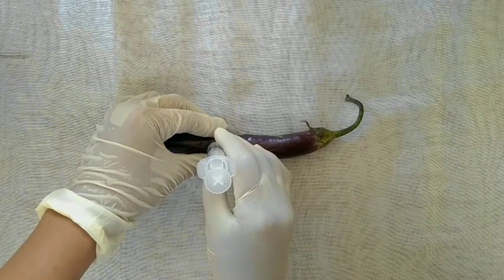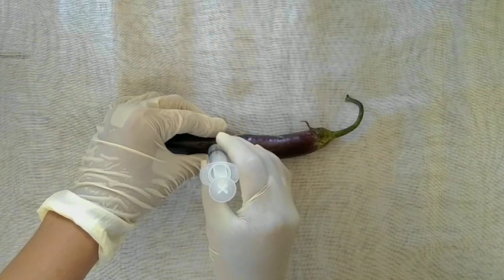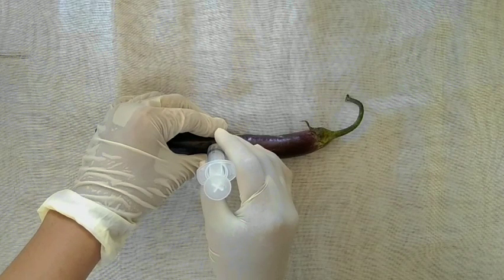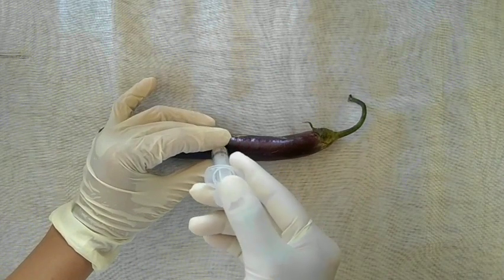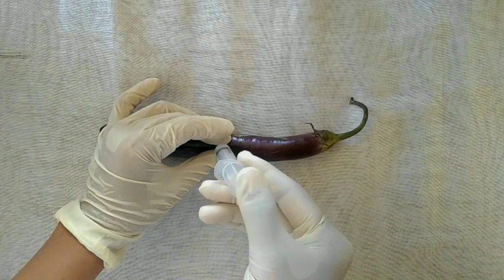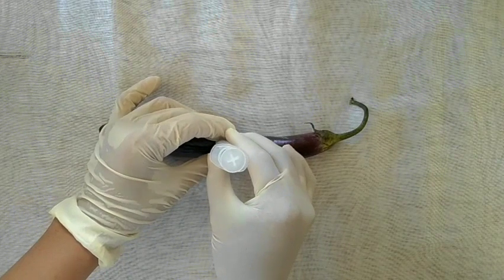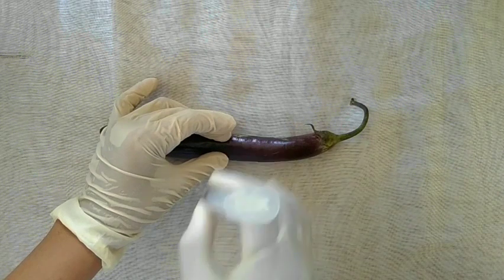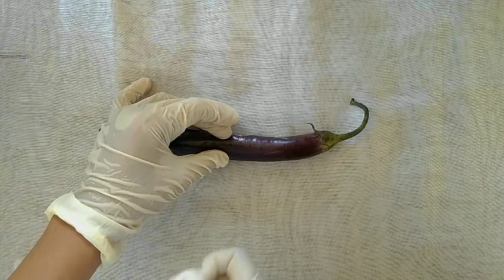And aspirate to see if there is blood. Then if there is blood, remove the syringe and get a new one. If there is no blood, then we can now administer the medication slowly for about 10 seconds. Then remove the needle from the patient's skin at the same angle as it was inserted. Then discard the needle and apply pressure to the injection site.